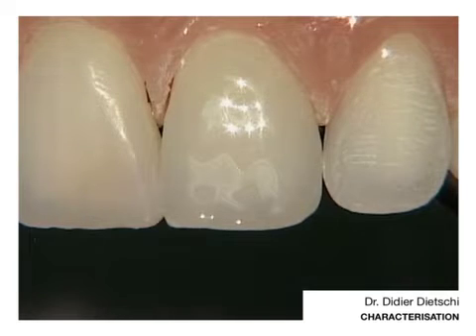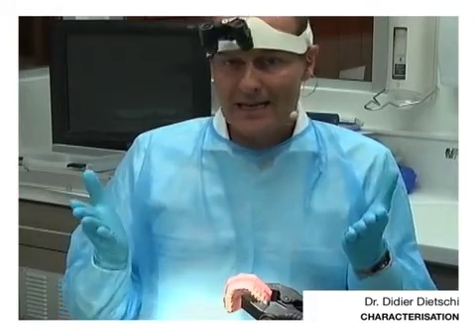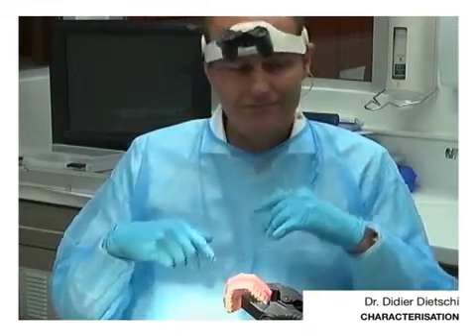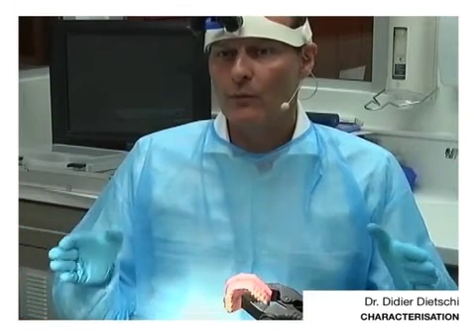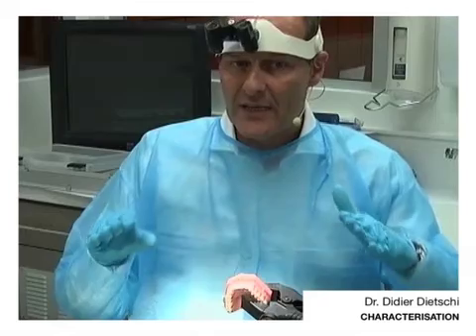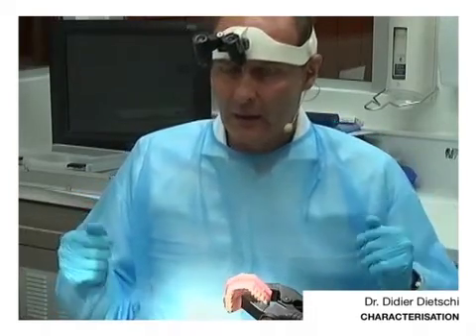What I will try now to demonstrate is the technique we use for a single veneer. You need to do a veneer because the tooth was broken, you have very large class 4 cavities on each side. The tooth has been already retreated several times and you realize that you won't be able to get a perfect result just by resurfacing the existing restoration. So basically the only way to get a good result is now to do a veneering technique.